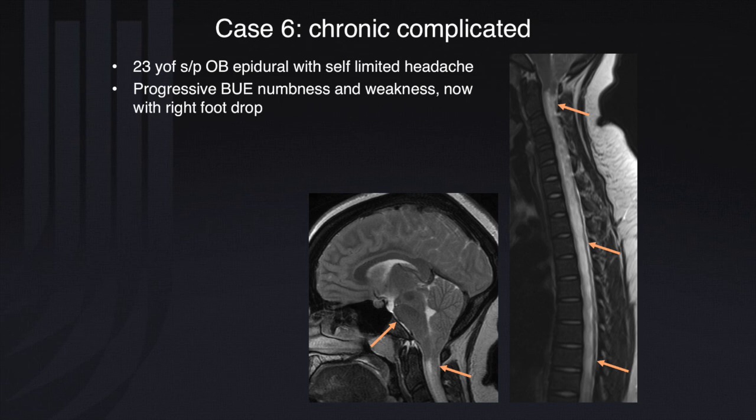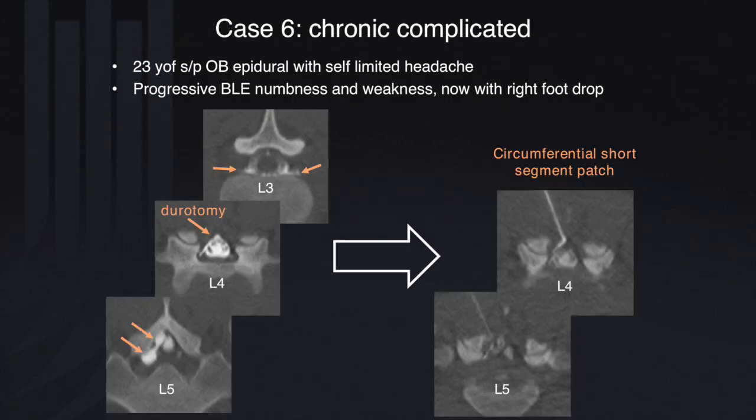We see basically all the signs of intracranial hypotension, reduced mammillopontine distance. But we've also got crowding at the foramen magnum, and we've got a pre-syrinx formation here, which if you continue down into the thoracic cord, you see that there's extensive pre-syrinx and edema and that kind of stuff. And so that's why she's got these myelopathic symptoms. The challenge here is now, she basically had this done. So this really bad situation.